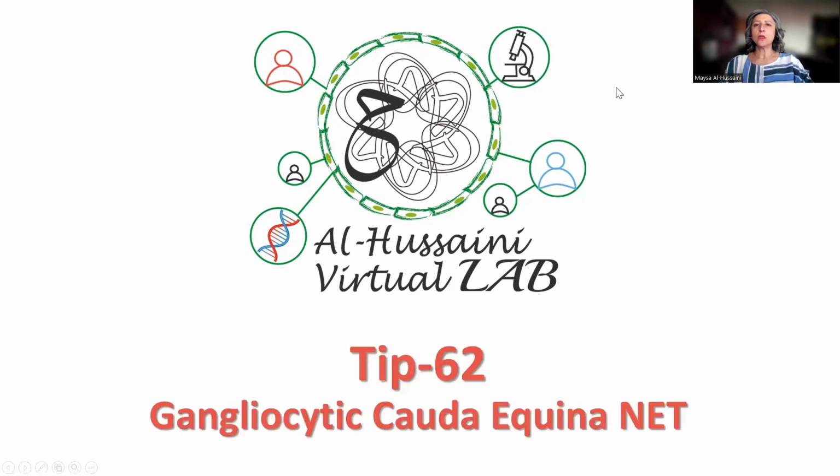What I'm going to be sharing with you today is a very interesting and rare type of tumor with a new nomenclature as per the new WHO classification of tumors of the central nervous system and endocrine system. This is Cauda Equina neuroendocrine tumor, formerly known as Cauda Equina Paraganglioma. What is really interesting about this case is that in addition to the neuroendocrine component, there was a gangliocytic component that is described in around 20% of cases.